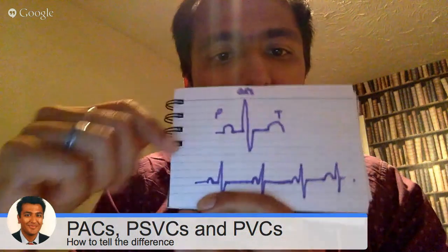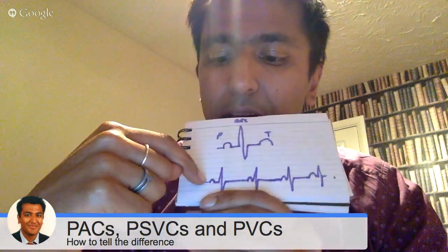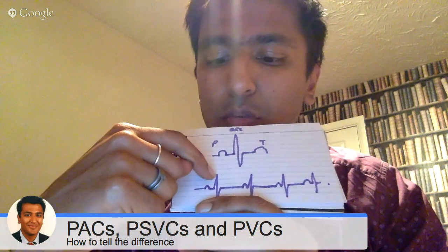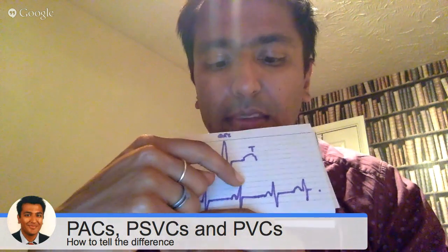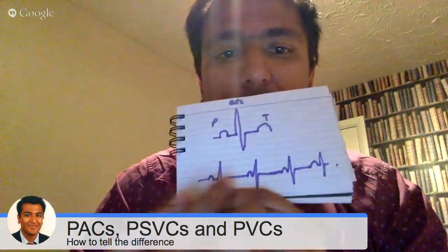So basically, what the guy does is here. Sorry, I can show you. Your pacemaker fires. The sound goes down. The impulse goes down into the ventricles, comes out. The echo dies down. The pacemaker fires again, and so on and so forth. And the distance between these is approximately the same. Okay.